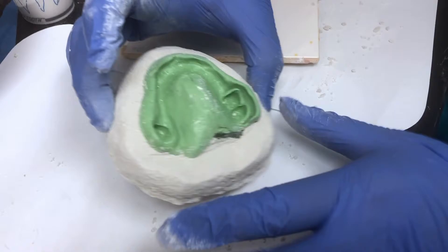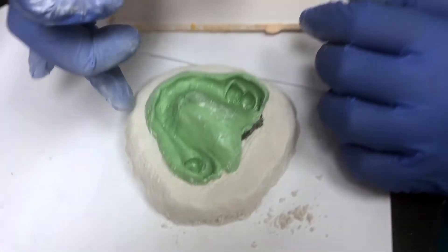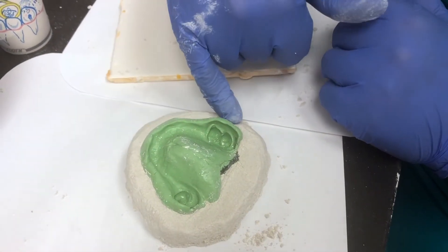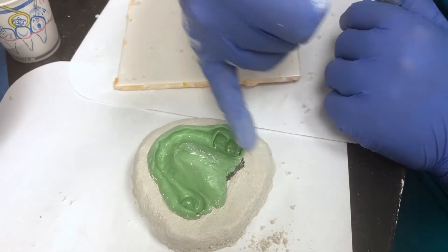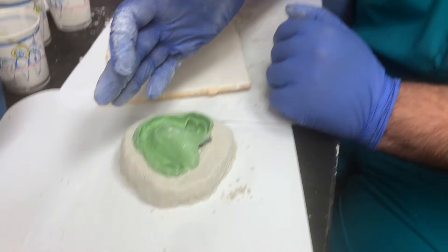Now I've basically got it to the height where I want. This area is a little too much, so I'm just going to take this to the trimmer and trim it to where I want it to be. I basically want to leave a land area of about three millimeters all the way around. The more confined and trimmed it is, the easier it is to box when you use the boxing wax — because if it's too big, you may have to use two pieces, and you don't want to do that.